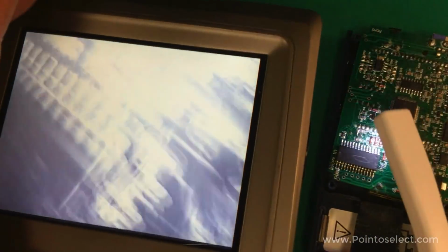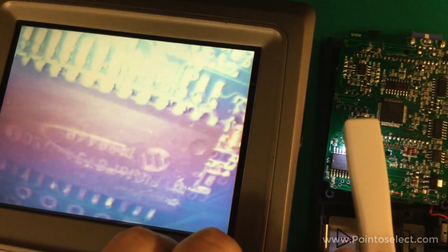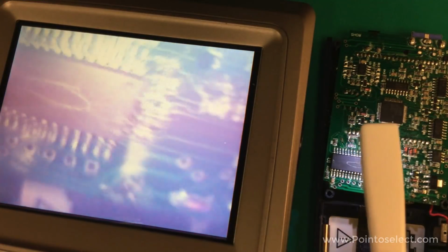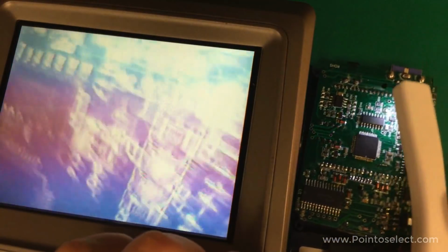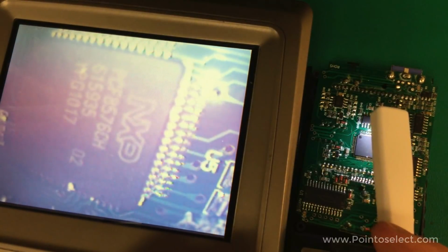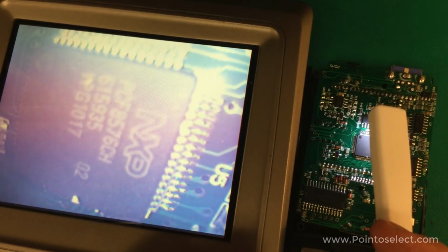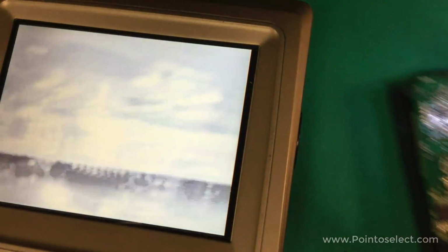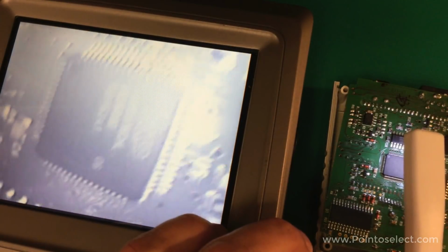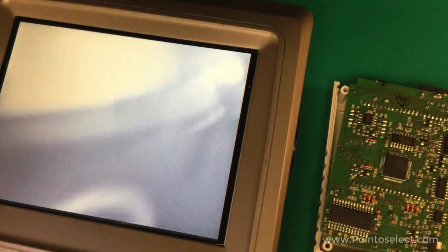And if we look over here, PIC 16F873A. Yeah, it's the same one. So same brain running these things, and then this other big circuit IC, which I think is the display driver. We have an NXP PCF8576CH and NXP PCF8576CH-L. That's probably just a family designation. It's the same chip. One might be a different temperature designation or something, but that's just running the display, so that's not going to change how your unit operates at all.